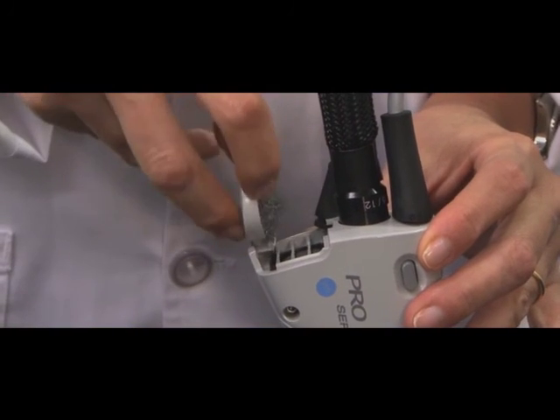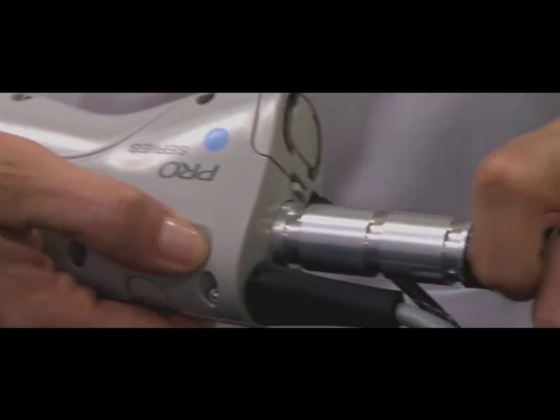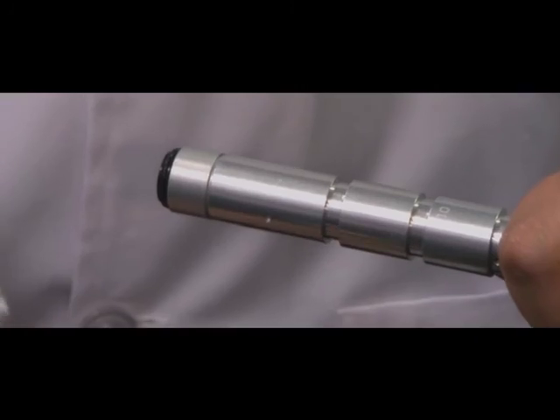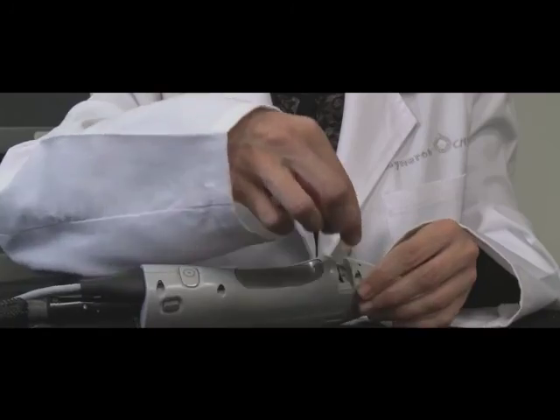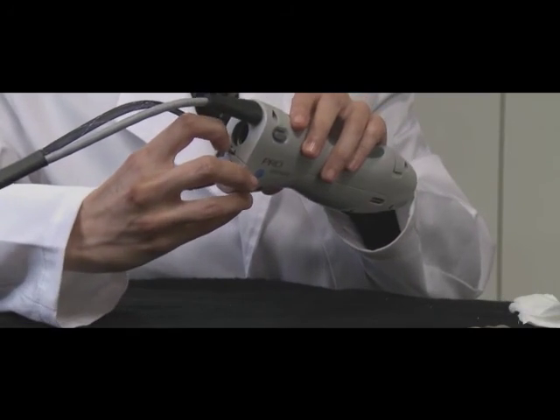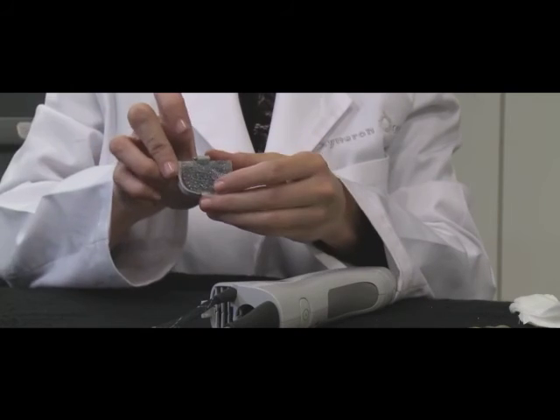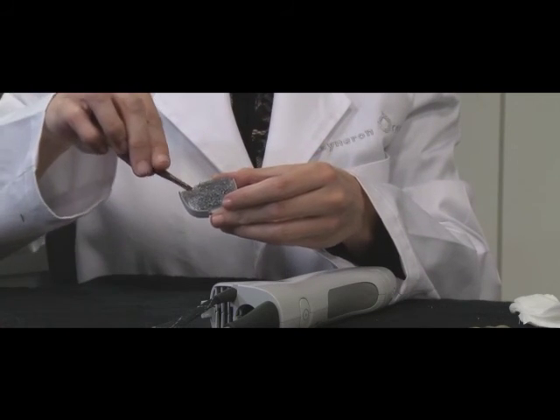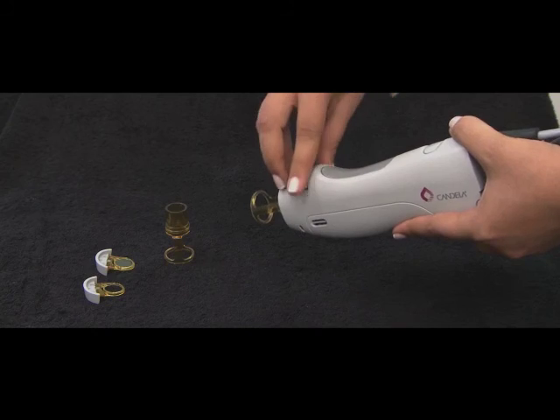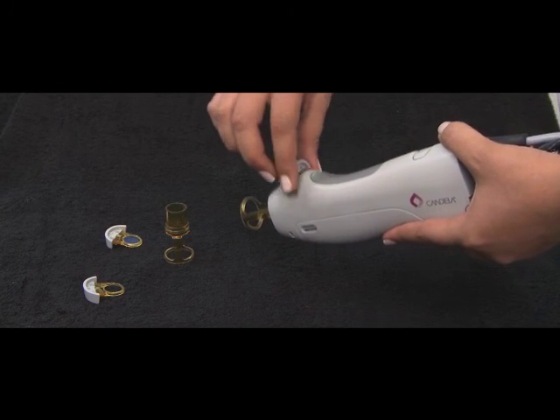The handpiece components are the filter, button release for slider attachment, inner tube for slider, and window holder. The filter is removed and cleaned once per week. You may wish to do this twice per week with heavy use. The window holder is easy to remove and replace.